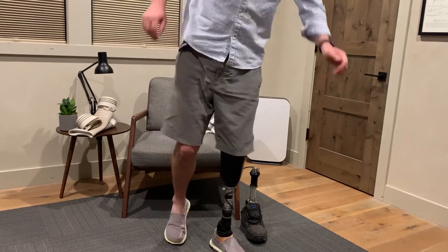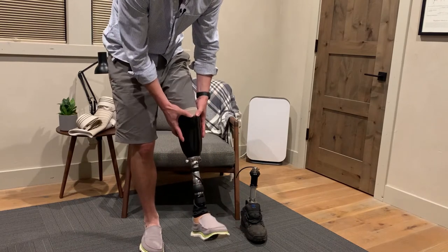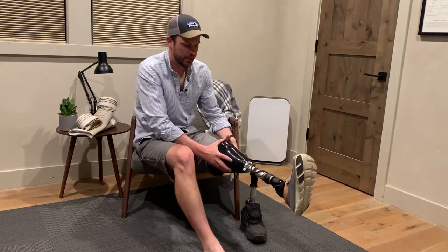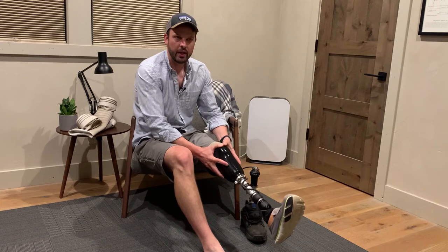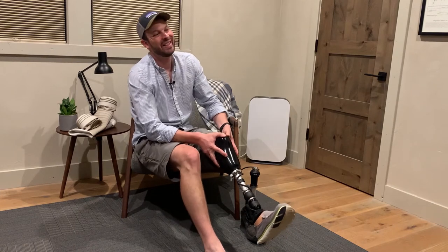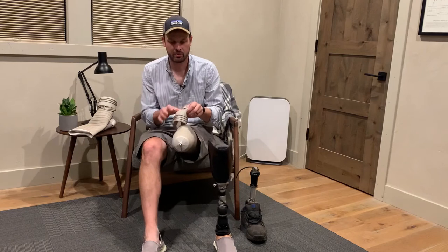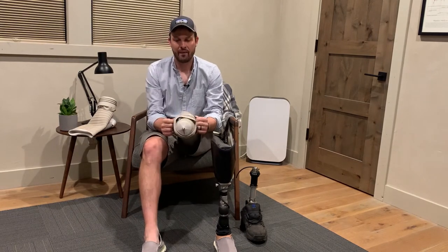It has some give — you can see that. I can take this and pull, and when you're walking that's kind of crummy. So it's easy to get on and off, but it's a little sloppy in the grand scheme of things.